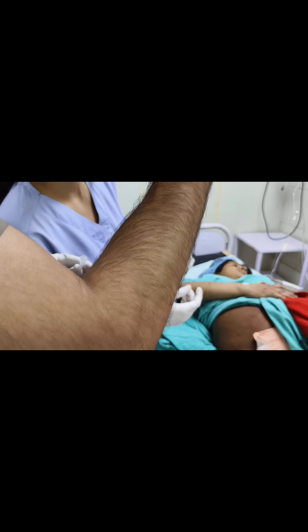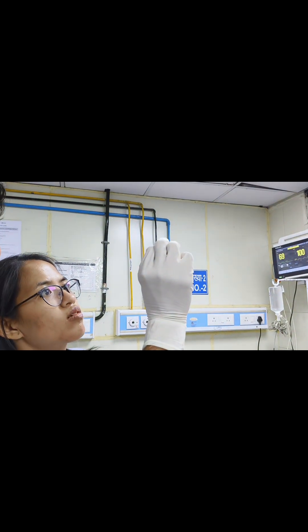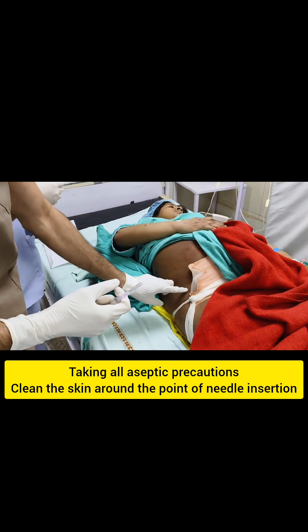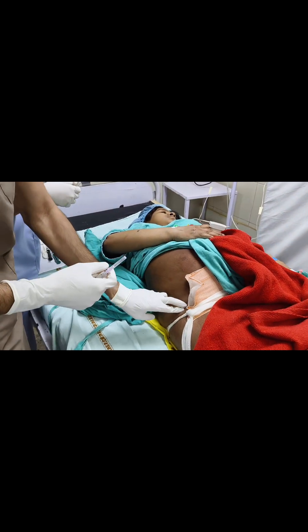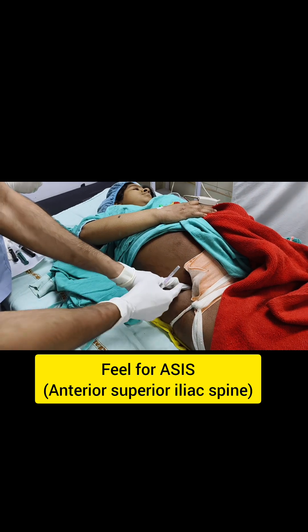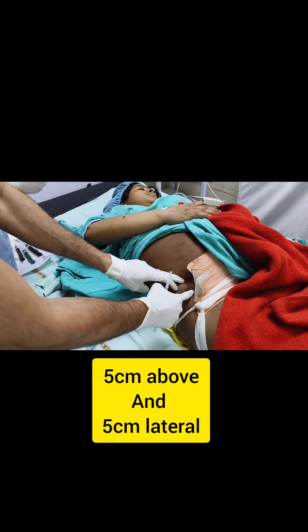Now the needle is blunted. You can see the parrot beak. Once the needle is prepared, you have to identify a point — the ASIS. This is the ASIS. 5cm above and 5cm lateral.